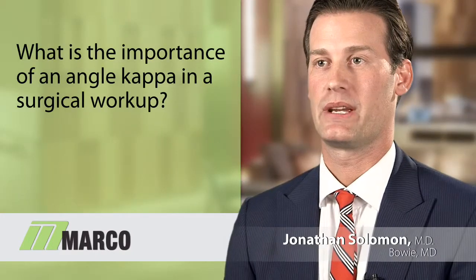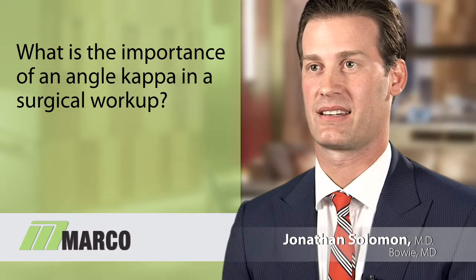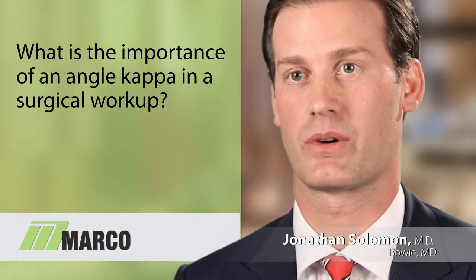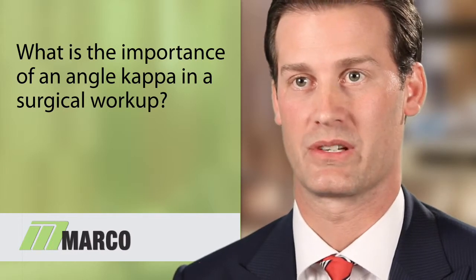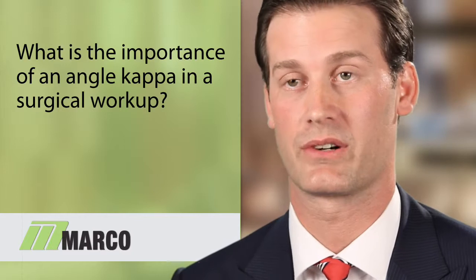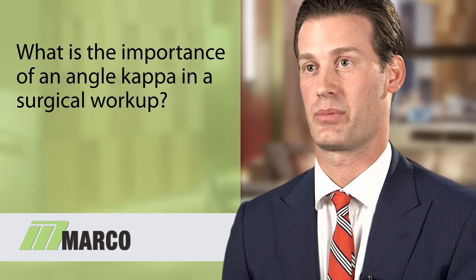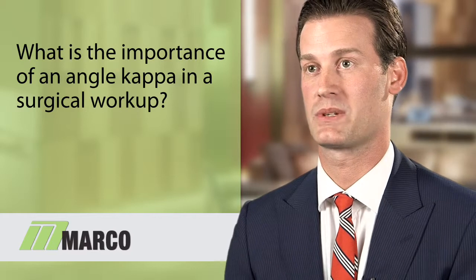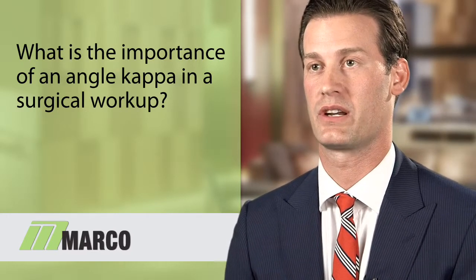The use of the OPD in better refining the exact type of implant, I think, is a critical aspect of achieving premium outcomes for patients, and that includes even monofocal lenses as well as multifocal lenses, certainly. But looking at an implant as it applies to a particular patient, or more specifically, a specific pupil size, is also very important.